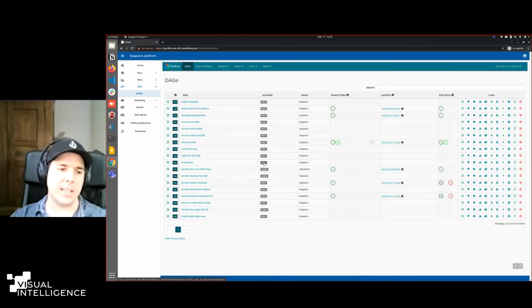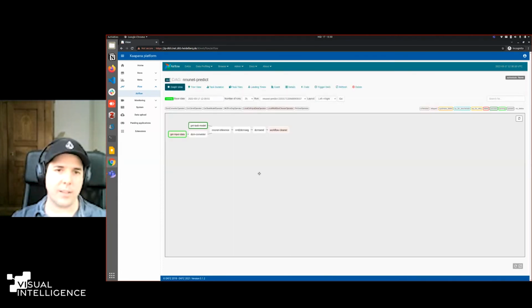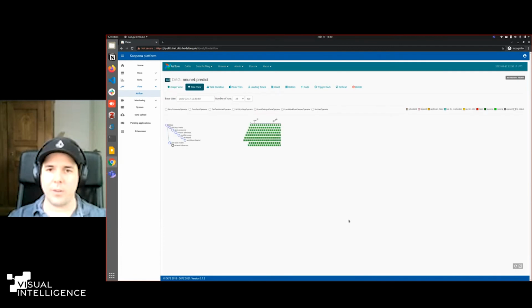And as I said, this is the data processing area. So everything, machine learning or data processing in general, happens here. And you can also see there's an nnU-Net workflow listed. And you also see there's a bright green coloring going on. So we see that there are currently five triggers going on.